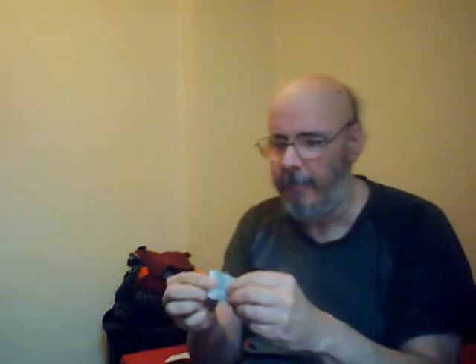Now, that's enough about the actual method that the product is dispensed in. I'm going to give myself an injection here so that you can see one of the most efficient adaptations of this particular system for giving a medication that's possible, and it's really cool. Okay, I have here my little pad for alcohol prep. It doesn't always rip where you want it to. That's called not being cool when you're filming. But it's now open, and I will access it.